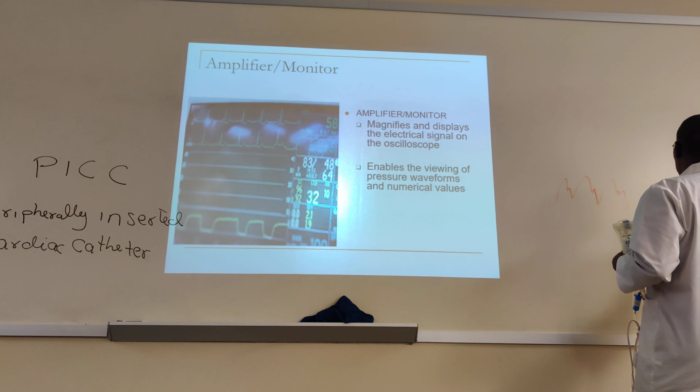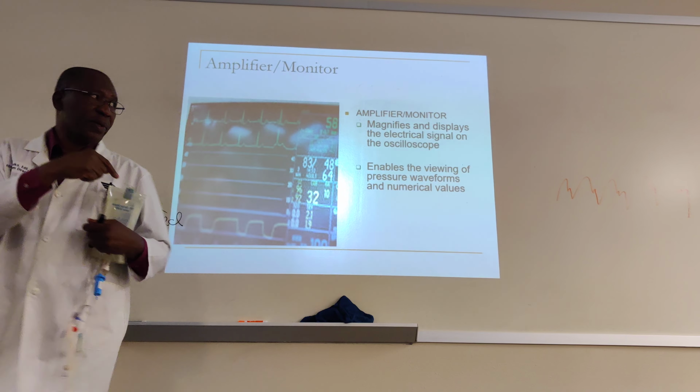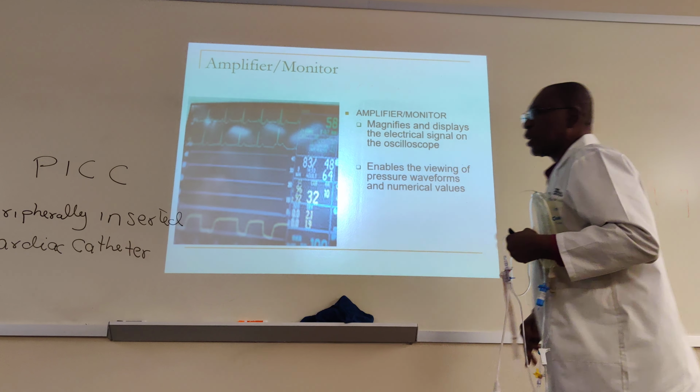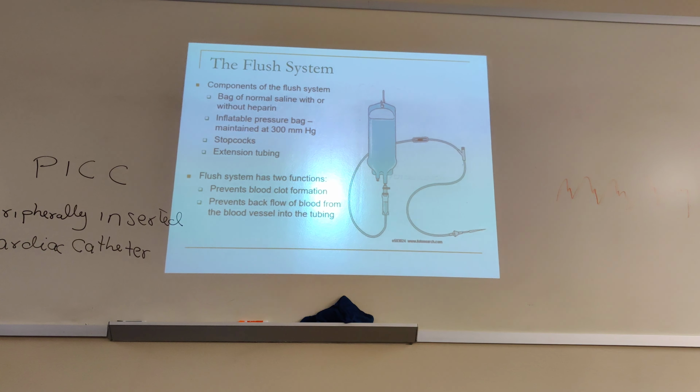Like that. So we have a line that is showing that way with the blood pressure at the end of it. Okay? All right, here is the flush system.